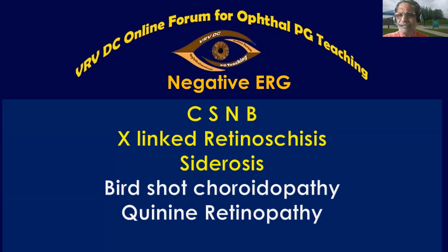In which cases can you have this negative ERG? Exam question again. Your answer, never forget this: congenital stationary night blindness, like fundus albipunctatus, Oguchi disease. These are all stationary night blindness cases. You can have negative ERG. Then the second thing is X-linked retinoschisis. X-linked retinoschisis patients can have negative ERG.